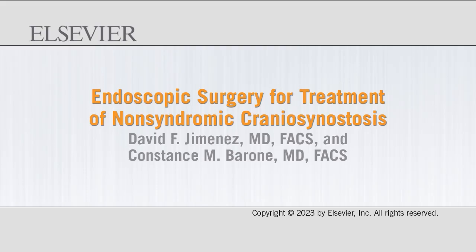In this chapter, we present the endoscopic techniques that we developed for the treatment of nonsyndromic craniosynostosis.